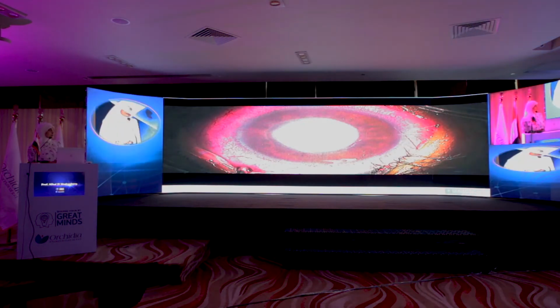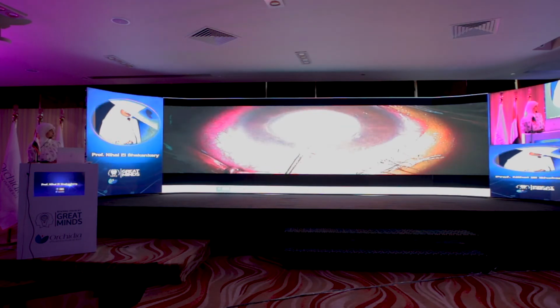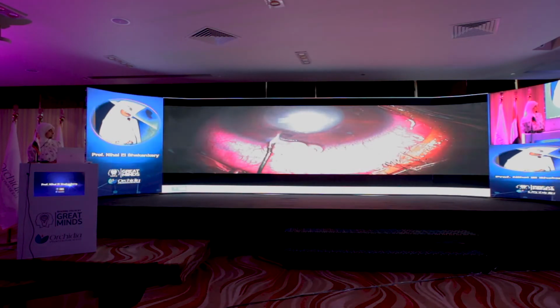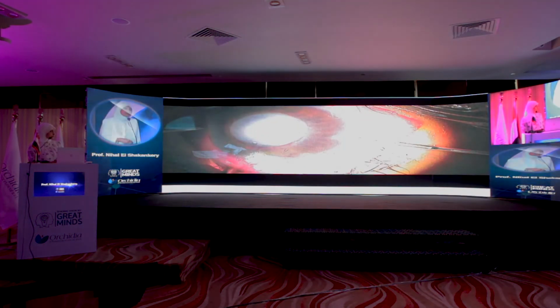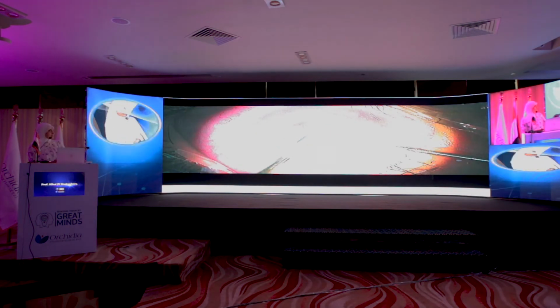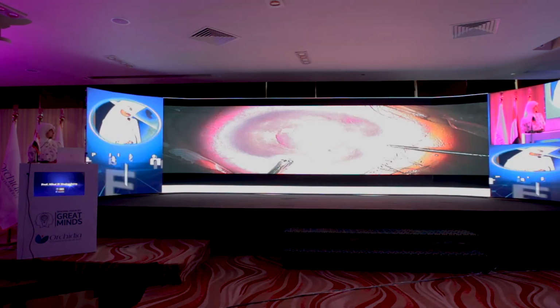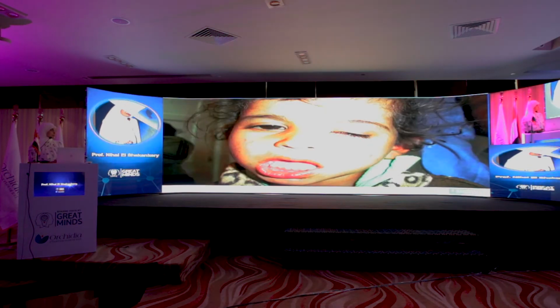This is another example with microspherophakia, cataract, pupillary block, and there is adhesion between the cornea and the iris. It was very difficult during surgery even to refill the anterior chamber with a viscoelastic. It goes out. However, we had to go for irrigation aspiration and anterior vitrectomy and clearing all the adhesions between the iris and the cornea before proceeding with the glaucoma.